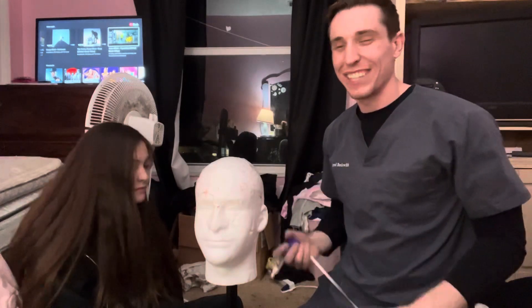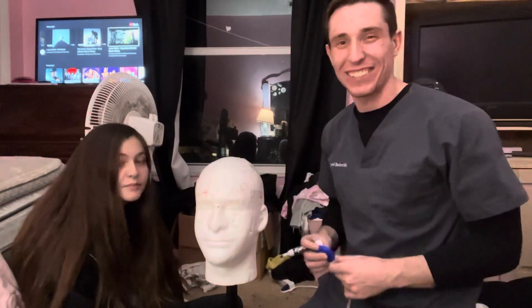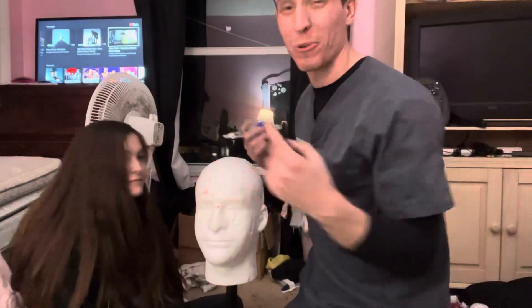Hey guys, welcome back to another video. My name is Jared, and today I'm teaching my little sister Sarah how to measure a head for an EEG.